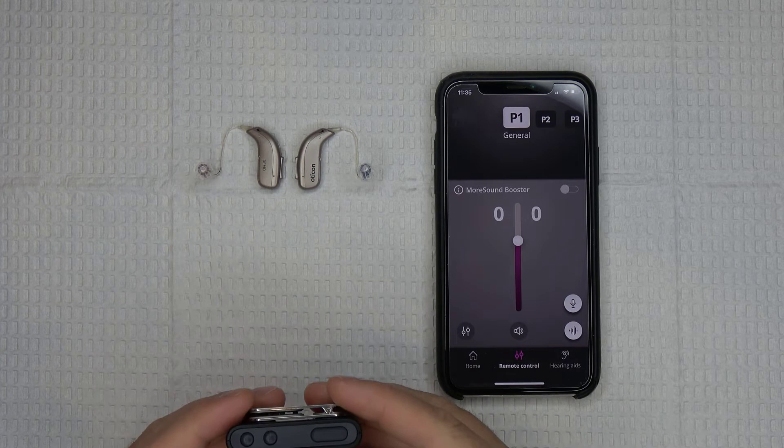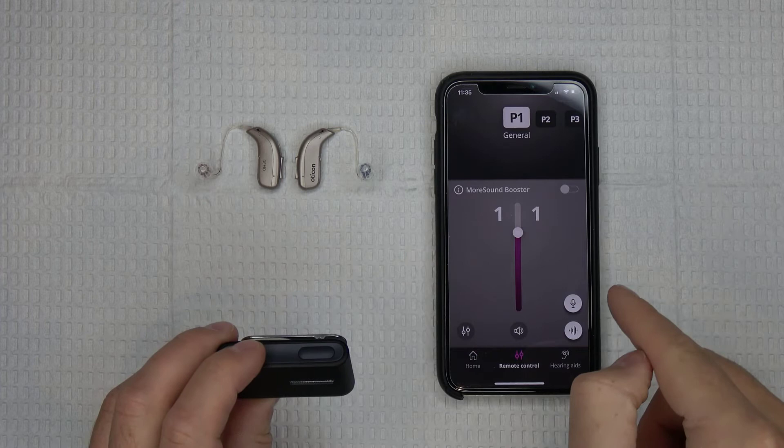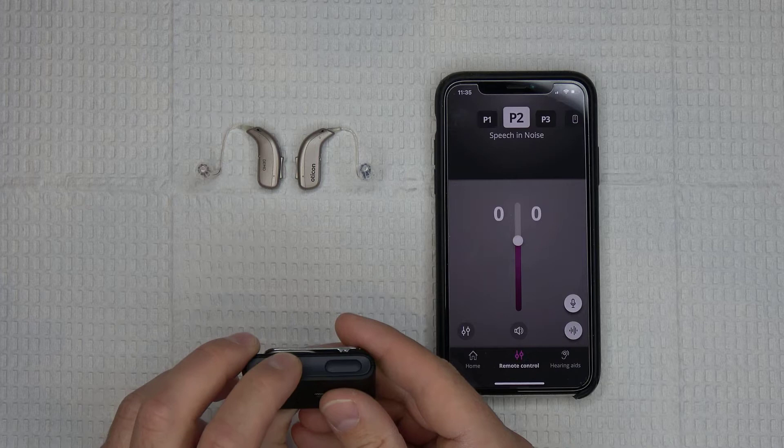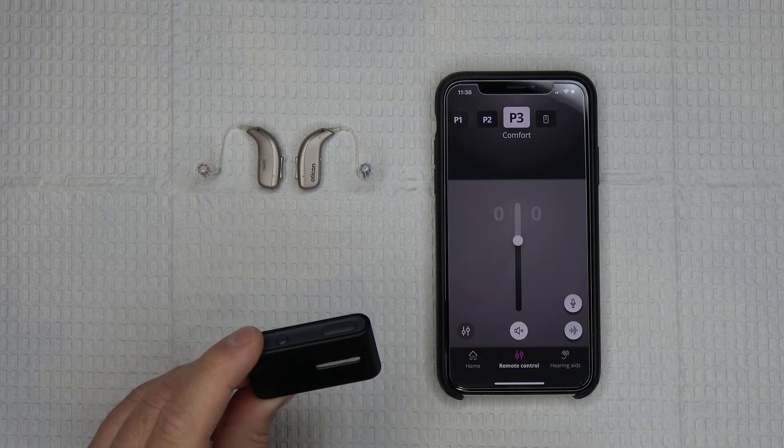Once you've connected the Connect Clip to your hearing aids, you can start taking advantage of two of the Connect Clip's main features: the remote control functionality and the remote microphone functionality. The remote control features become available as soon as the Connect Clip is turned on and paired with your hearing aids. When turned on and paired, a short press of the plus or minus button will raise or lower the volume in the hearing aids, while a long press of the plus button will cycle through your hearing aid programs, and a long press of the minus button will mute your hearing aids. To unmute, simply give the plus or minus button a short press.